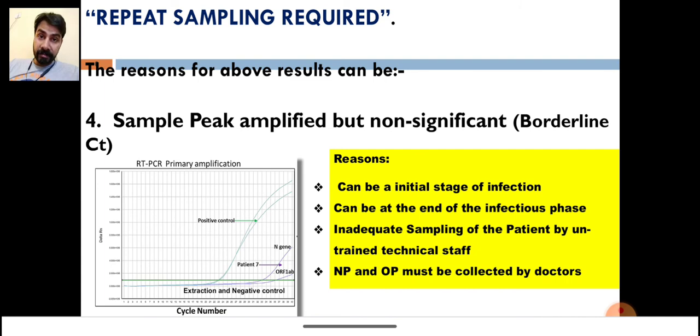We cannot omit that patient as negative. We cannot declare that patient as negative. In that case, we will declare repeat sampling required. This is the safer and the best side to declare the result as repeat sampling required.